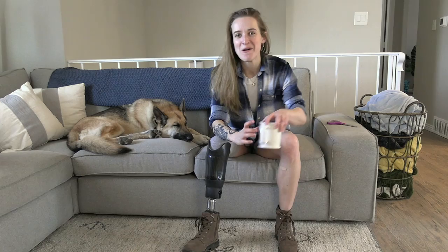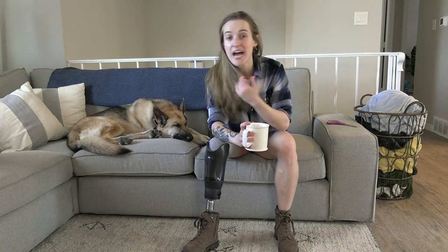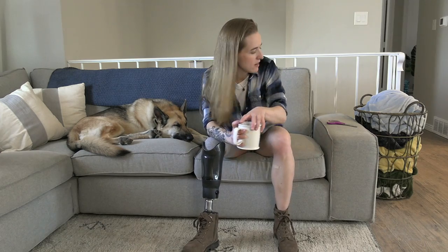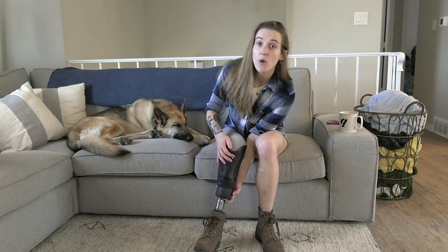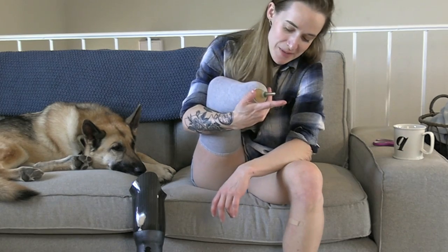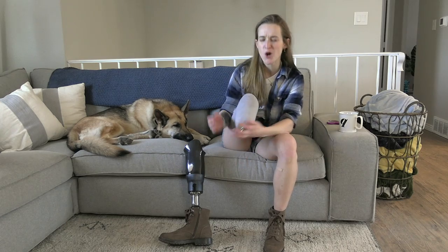All in all, I would call this a major success, though I don't know how it's going to go. I would say that a couple of the downsides for me personally are when I am taking off my leg and sitting somewhere, I now have this screw coming out the bottom of my leg, which looks kind of funny. It's harder to get comfortable.